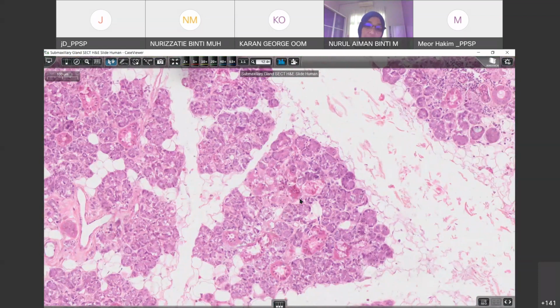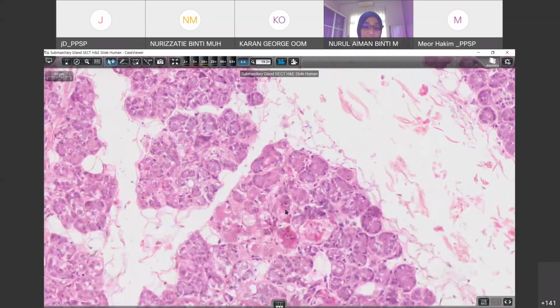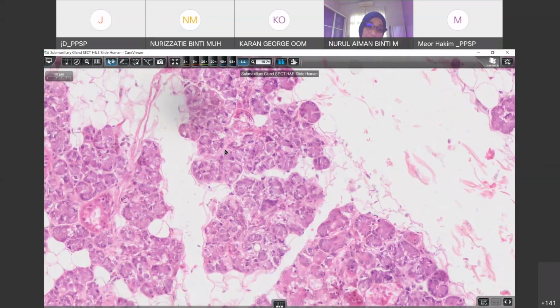This is an acina type of gland because you can see its shape is like grapes. Each of the glands is shaped like grapes. So this is compound acina type of gland. That's why you can't see the tubular structure here. You can't see the lumen because it's acina.